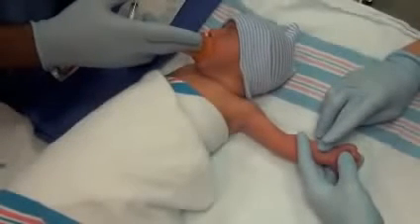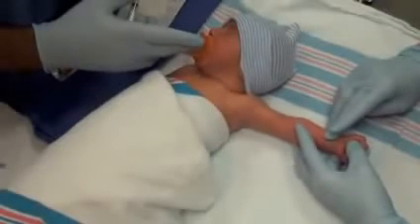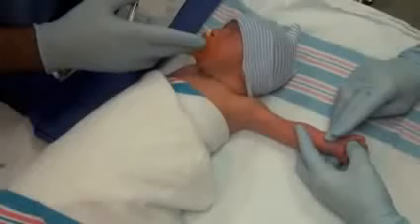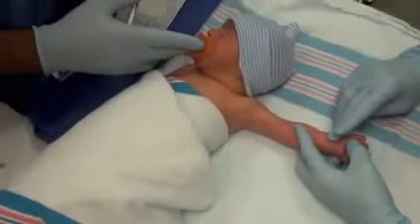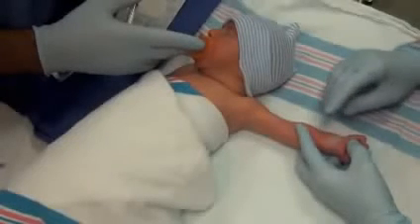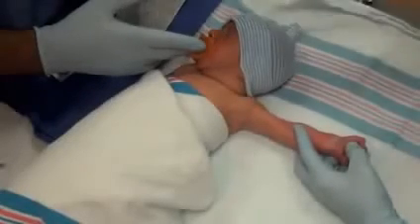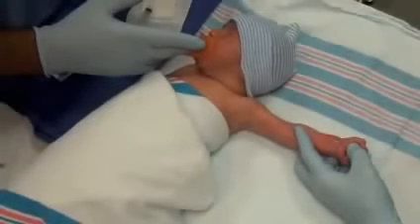A modified Allen's test should be conducted on the posterior tibial artery and the dorsalis pedis artery to assess for collateral circulation before a lower extremity arterial puncture is performed. The wrist is stabilized and placed in the neutral supine position. Be careful not to hyperextend the wrist as this may occlude the vessel. Cleanse the insertion site and the surrounding tissue.